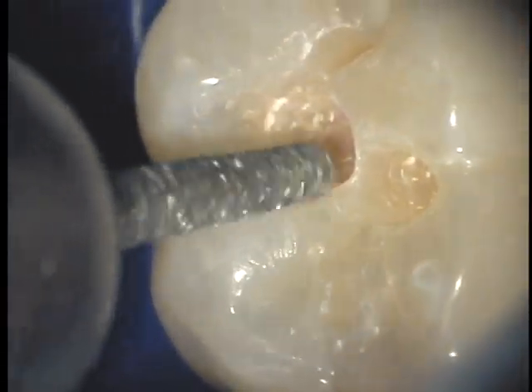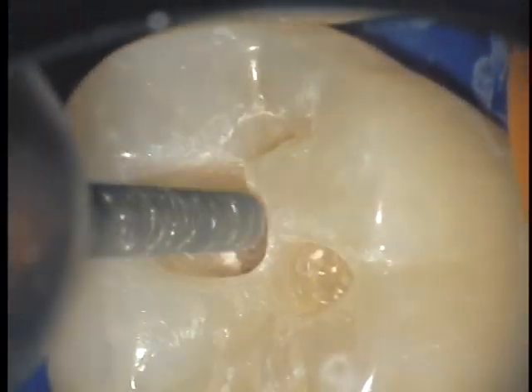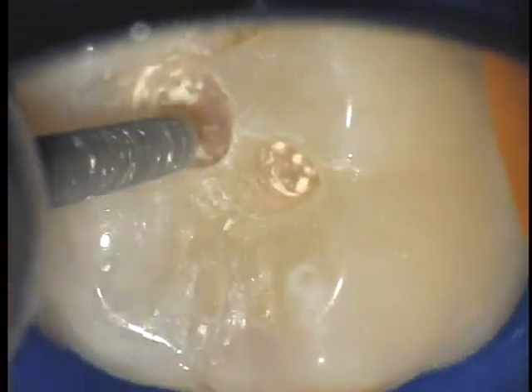Beveling of occlusal enamel remains controversial. However, I find that it gives me the best chance to avoid those white lines that often form at the margins of composites.